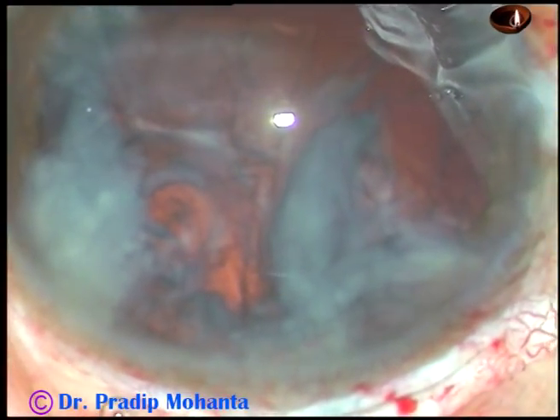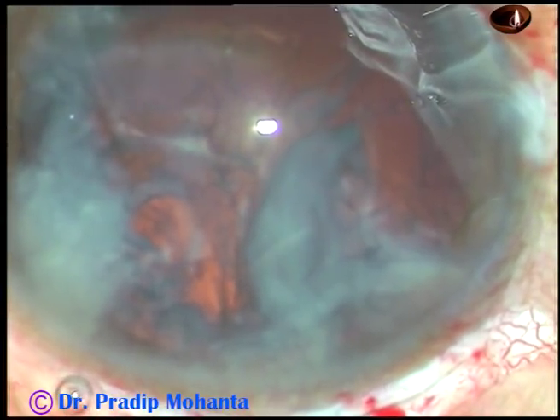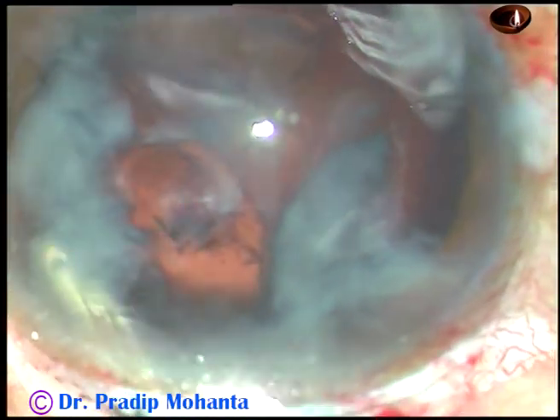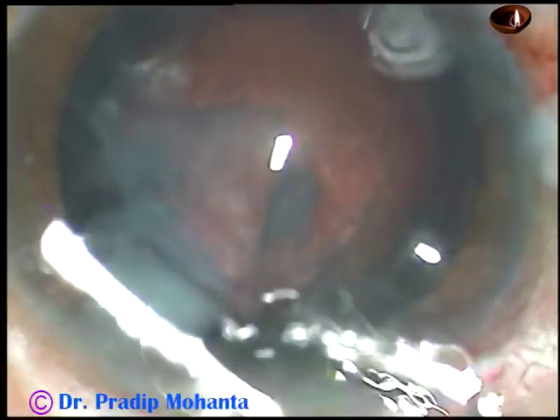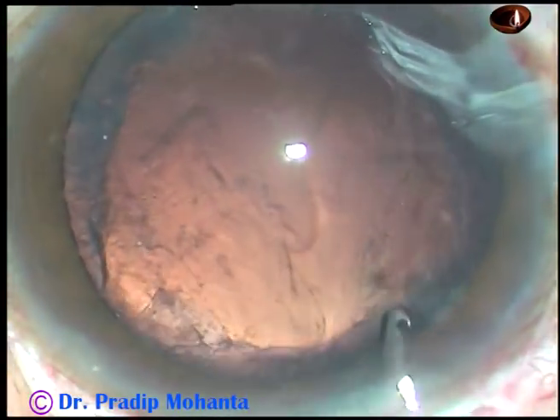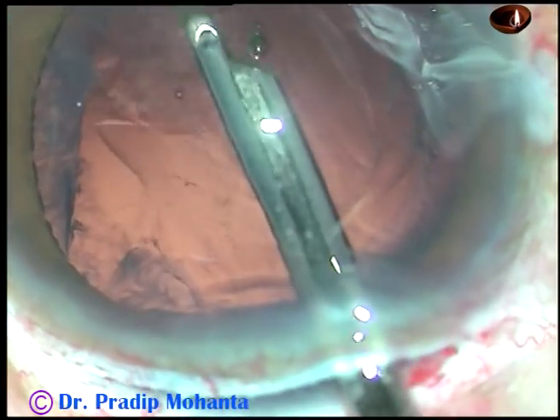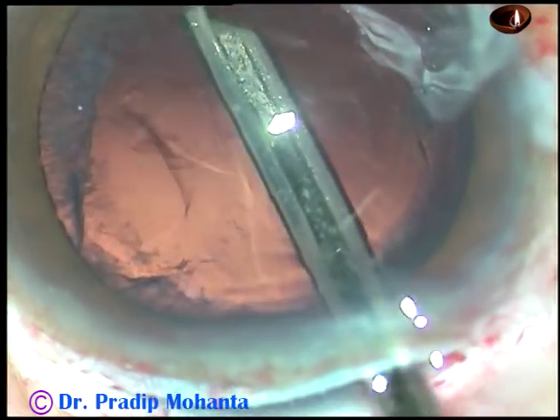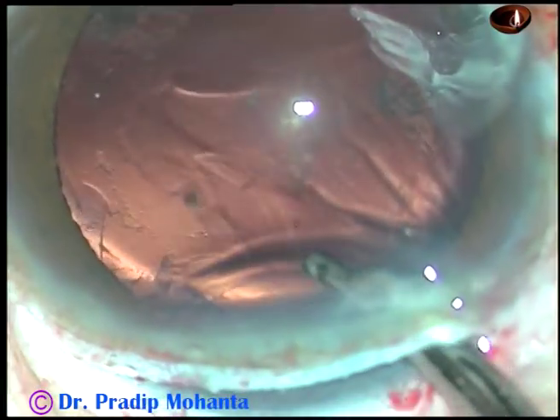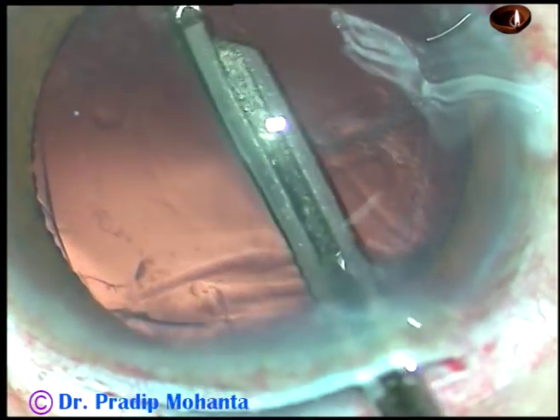Now you have to remove the cortical matter. You can use the Simcoe cannula. There is viscoelastic substance in the anterior chamber. It is not a vertical cut — it is a small tunnel, and you can easily remove a lot of cortex through the main incision. Going through the main incision, the anterior chamber doesn't become shallow.